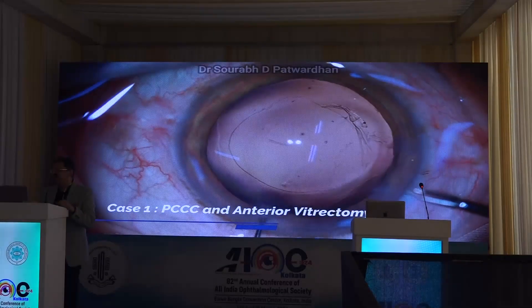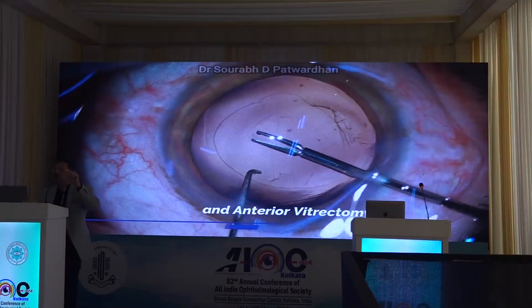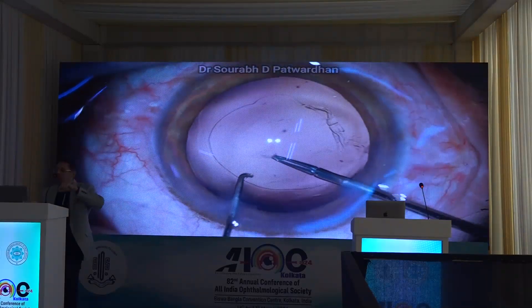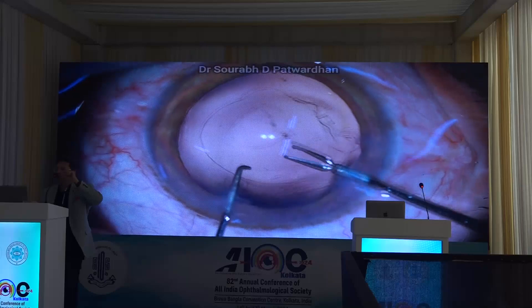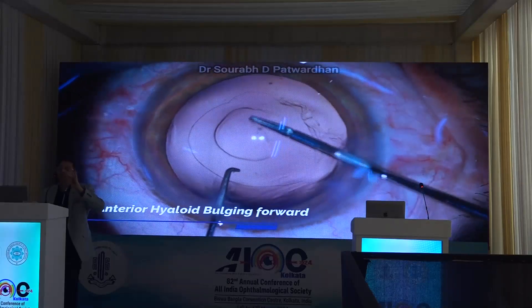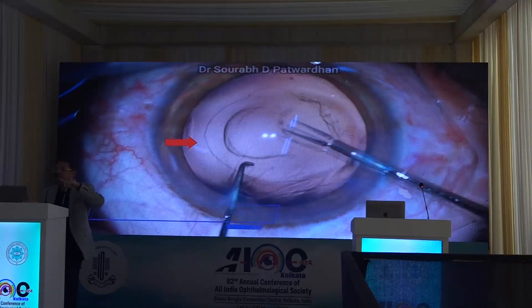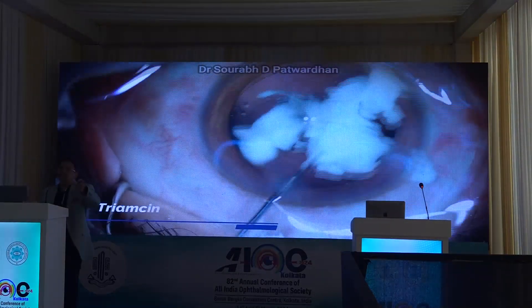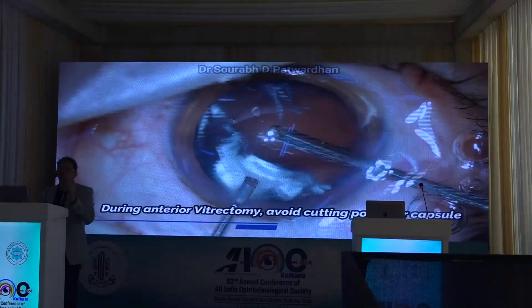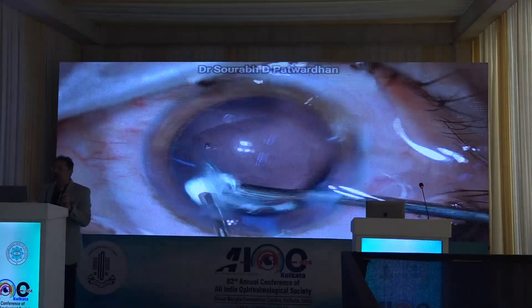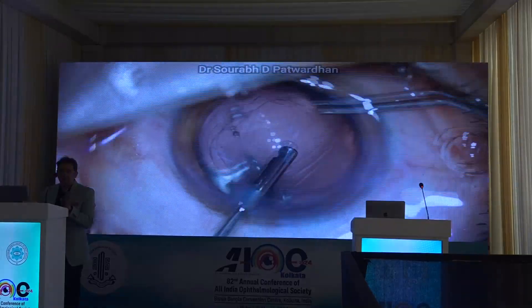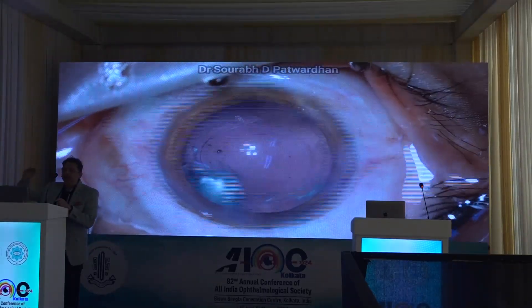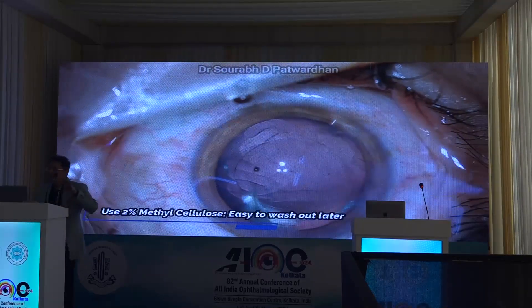Here in this video, there is a PC rupture and the anterior hyaloid is intact. I am trying to convert it into a posterior capsulorhexis. The most important principle is to keep the anterior chamber well maintained. In this clip, I am not doing that and the anterior hyaloid starts prolapsing and the vitreous gets disturbed. The only way forward now is to complete the anterior vitrectomy before placing the IOL in the bag.